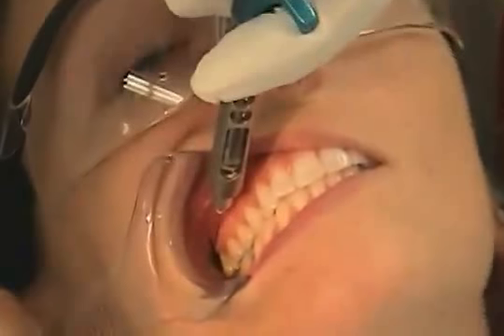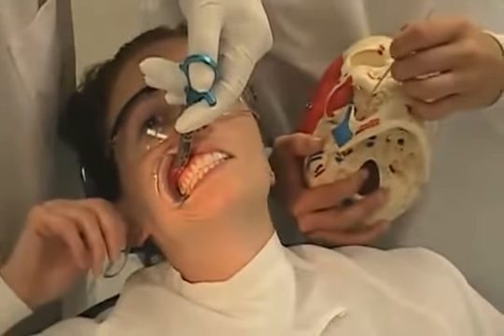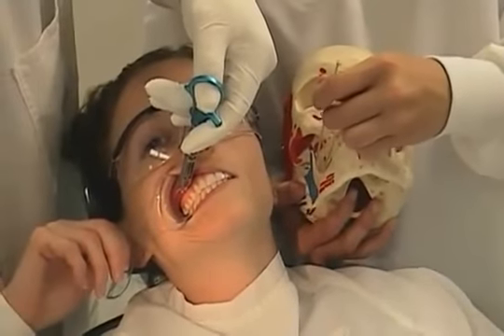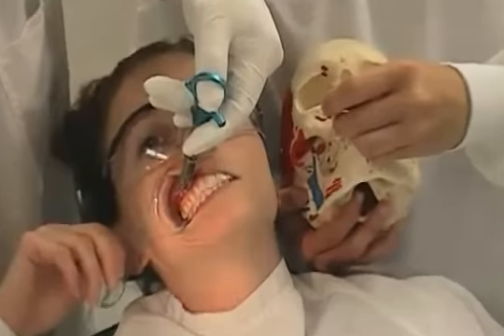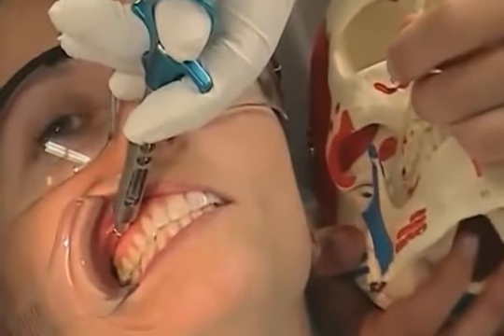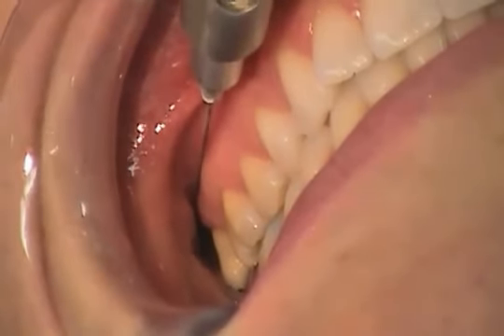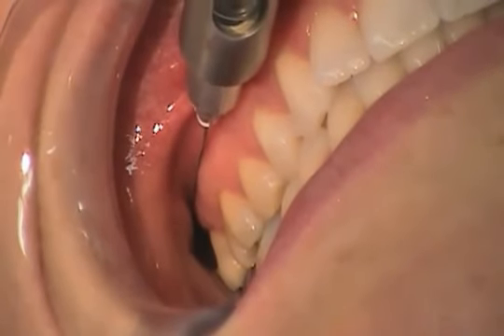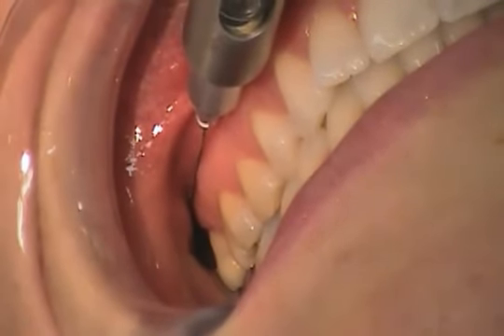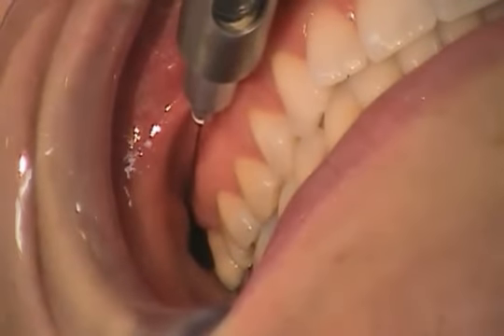Visualize landmarks: the mucogingival junction of the maxillary third or second molar, the maxillary tuberosity. Prepare the tissues as normal by drying with sterile gauze and applying topical as needed. Advance the needle 25 millimeters into tissue. Aspirate, and if negative, deposit 1.5 to 1.8 milliliters over approximately 60 seconds.